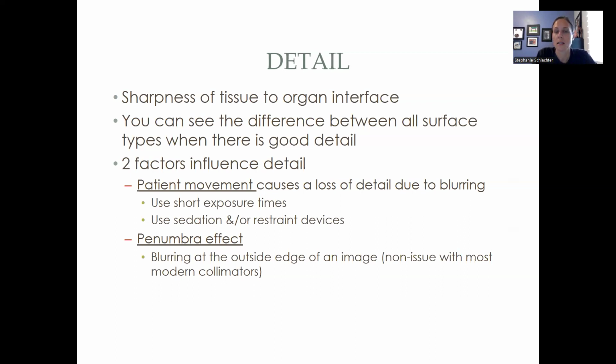And there's two main things that affect our detail, and that's patient movement, right? So if the patient is panting or trembling or anything like that, you're going to get blurring, right? And so then you lose that sharpness, that detail, just like when you're taking a picture and you've got a slower exposure time, right? Somebody's running, they're blurred. That's the same thing that we're talking about there.